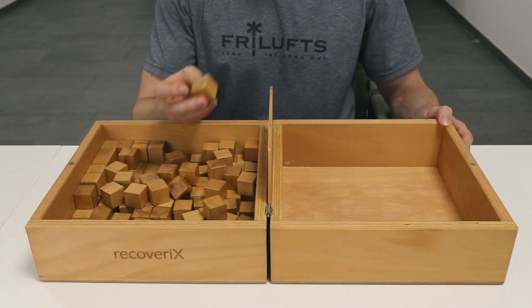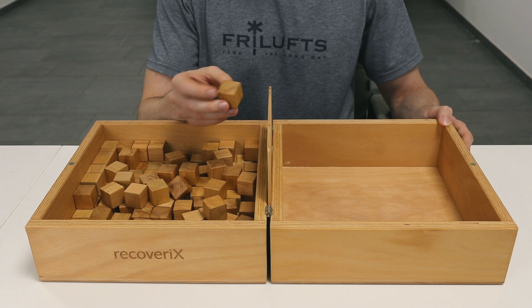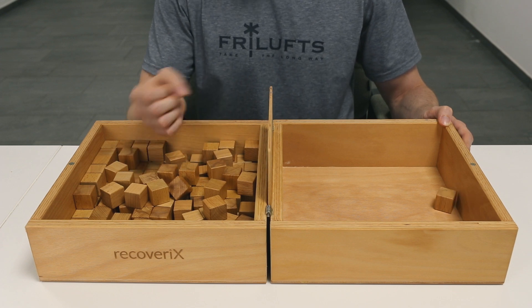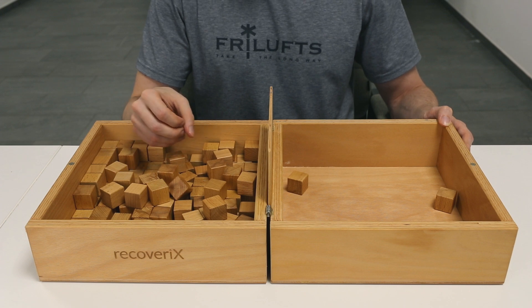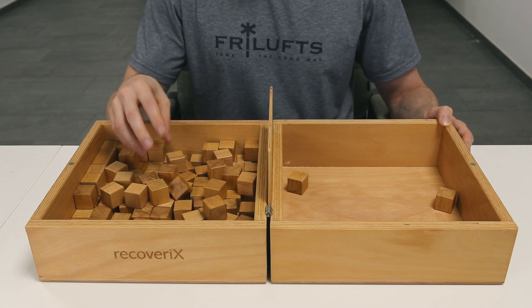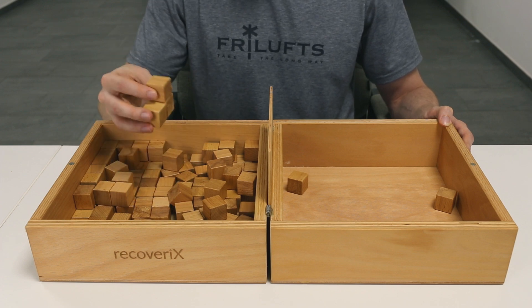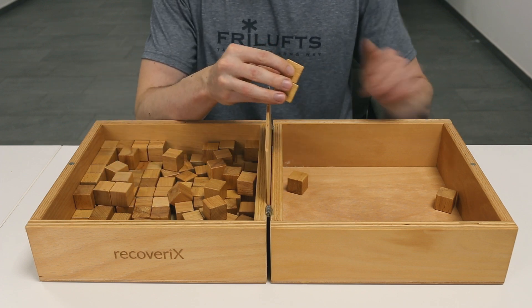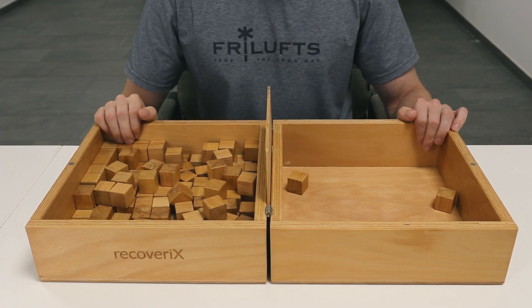The Box and Block Test is scored by counting the number of blocks carried over the partition from one compartment to the other during the one-minute trial period. The patient's hand must cross over the partition for a point to be awarded. Blocks that drop or bounce out of the second compartment onto the floor are still rewarded with a point. Multiple blocks carried over at the same time count as a single point. Higher scores indicate better gross manual dexterity.